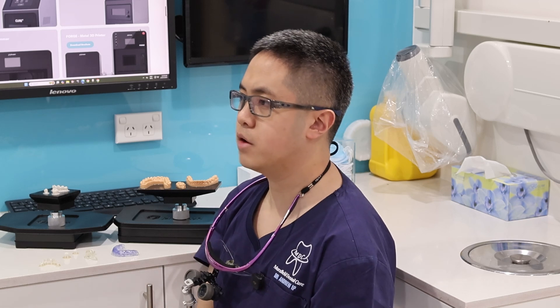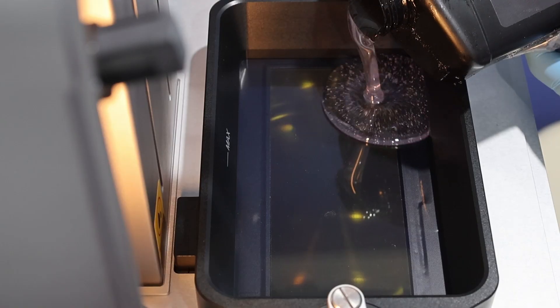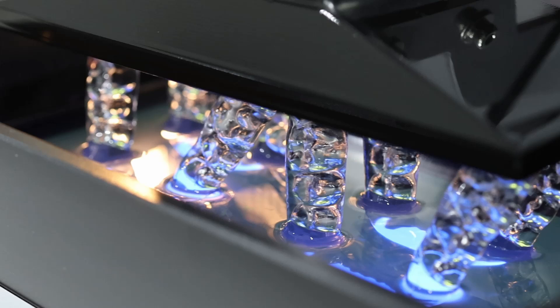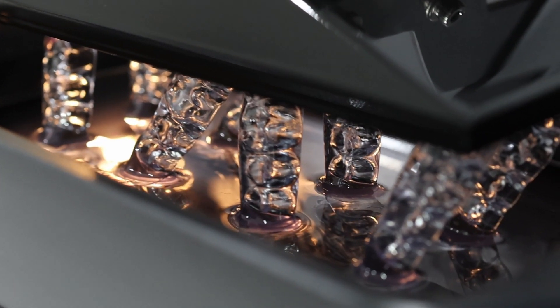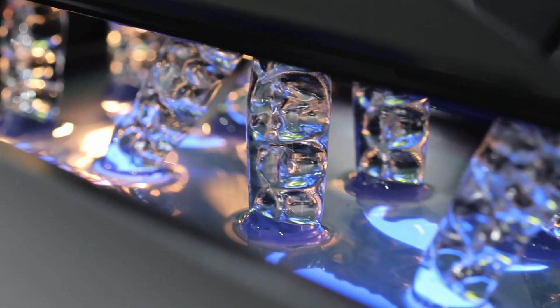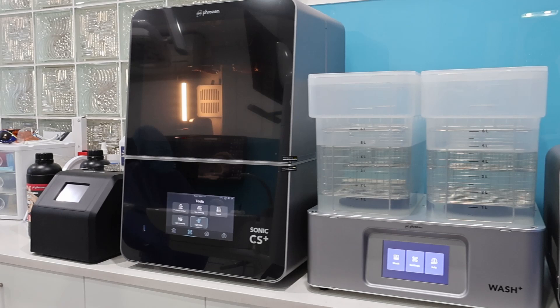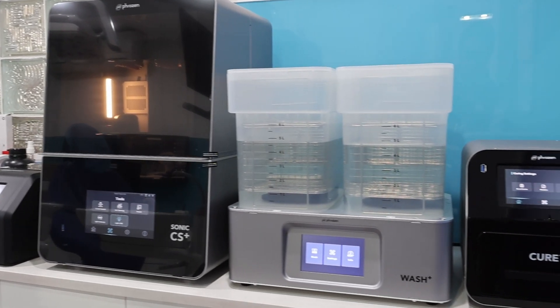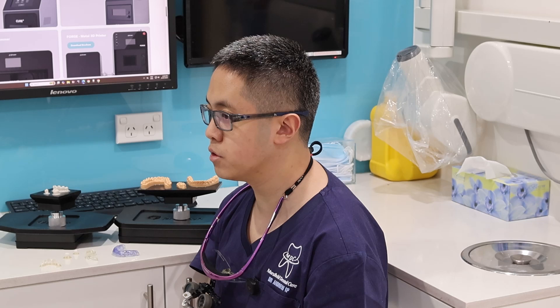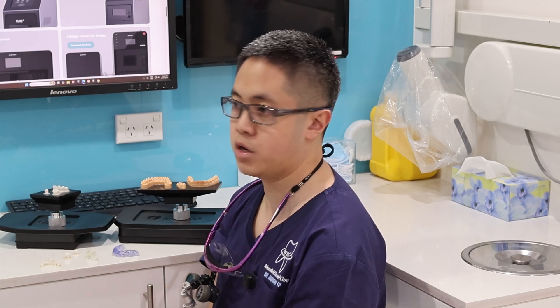So who would I recommend the Frozen CS Plus to? Well, I think anyone who is looking to introduce dental 3D printing into their labs or offices without breaking the bank, and yet having most if not all of the bells and whistles you'd find in a very high-end dental 3D printing system — then I would look no further than the Frozen CS Plus range. It's a very cost-effective bundle and great for those who want to get into 3D printing without sacrificing quality or consistency.